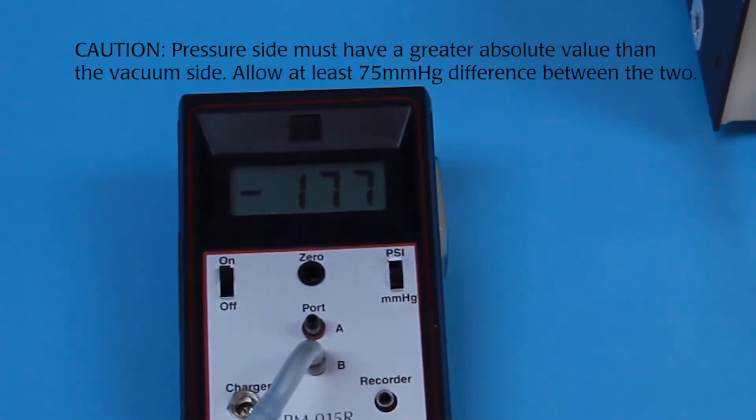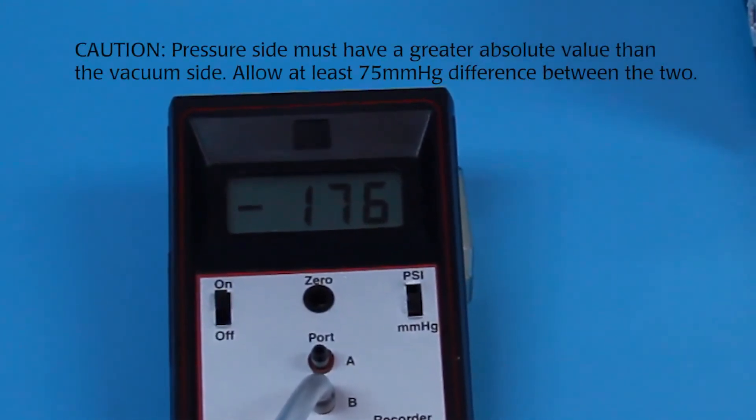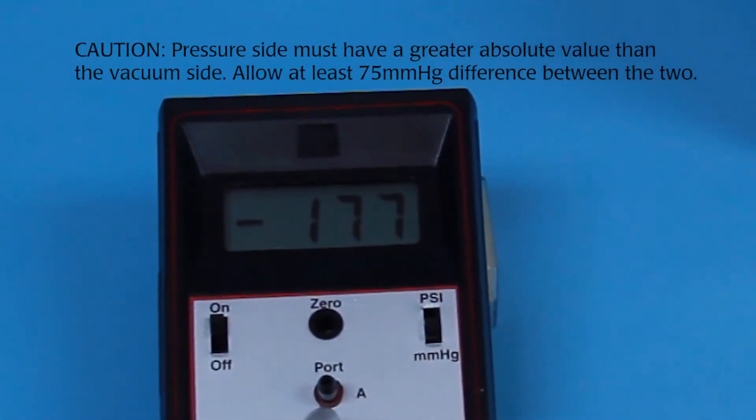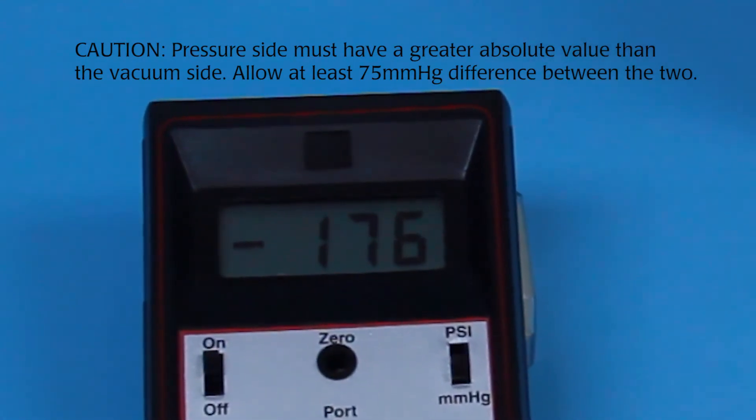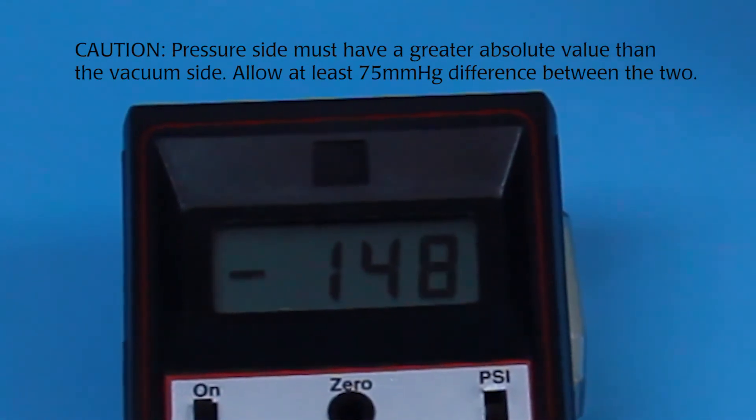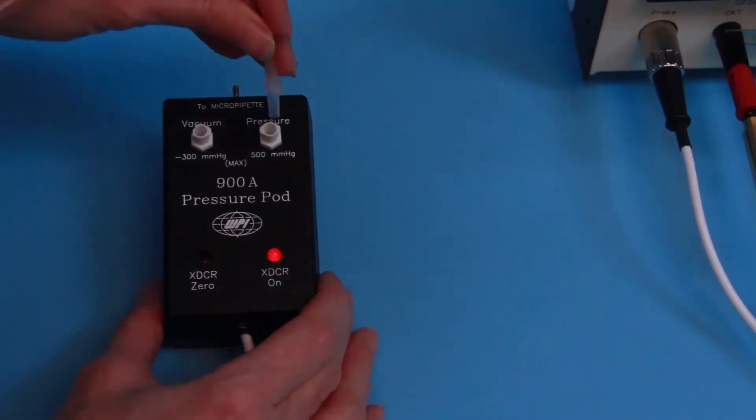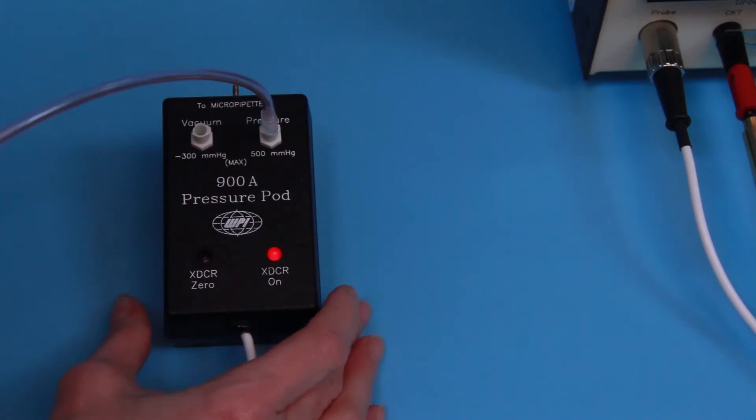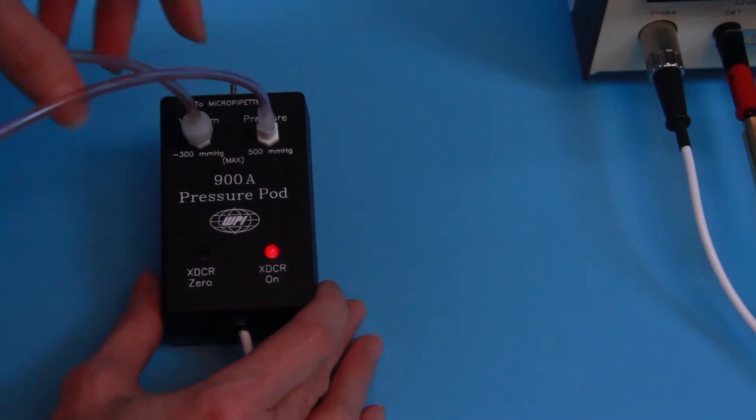However, it is crucial that the pressure side always be of a greater absolute value than the vacuum side and that there is a minimum of 75 millimeters of mercury difference between the pressure and the vacuum sources. Connect these related pressure and vacuum sources to their respective input ports on the pressure pod.